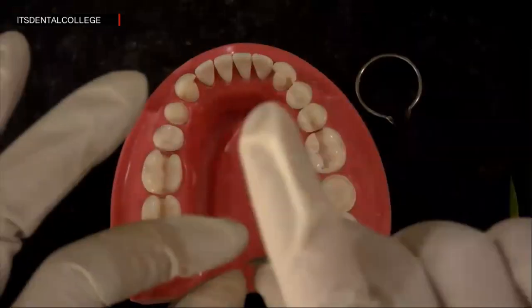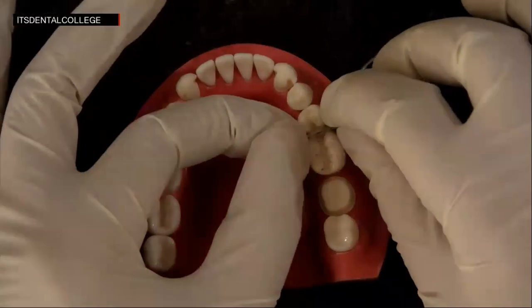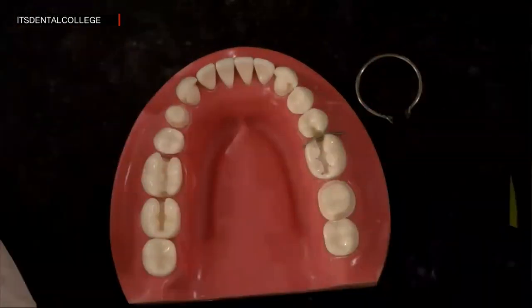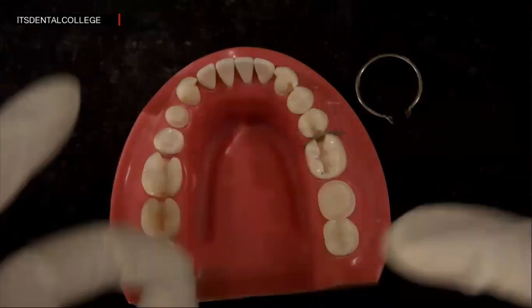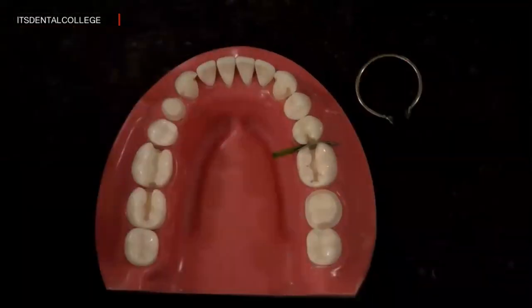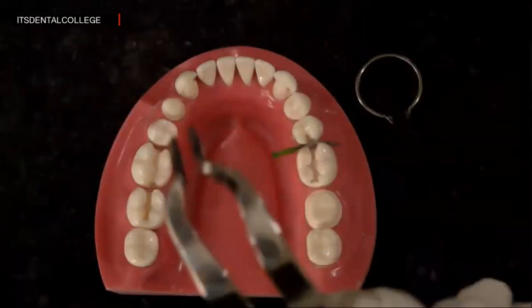So we are placing a sectional ring now. First, what we do is we place the band. And then we have to place the wedge. After which we'll use the forceps, and then we will place the ring.